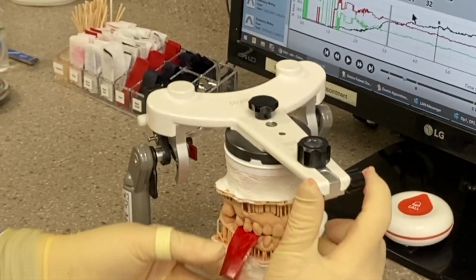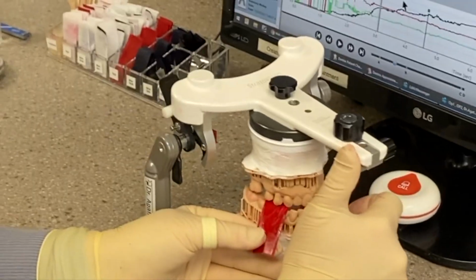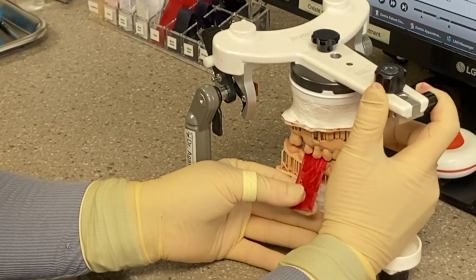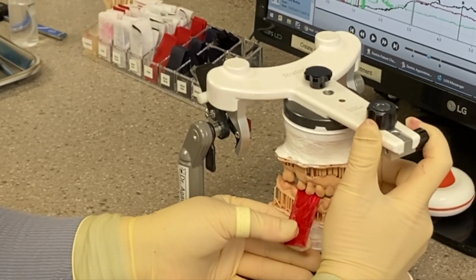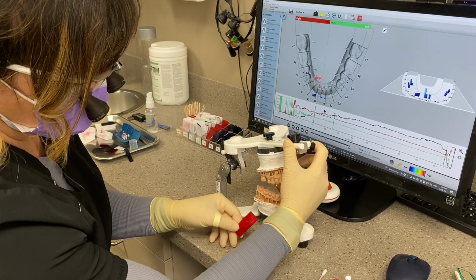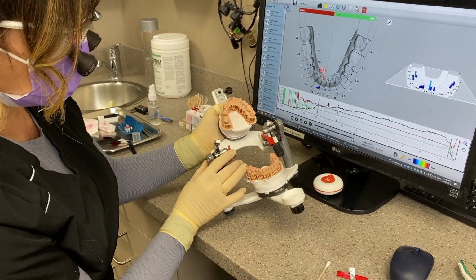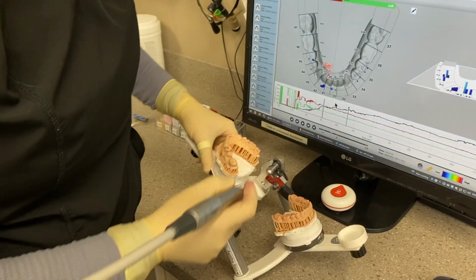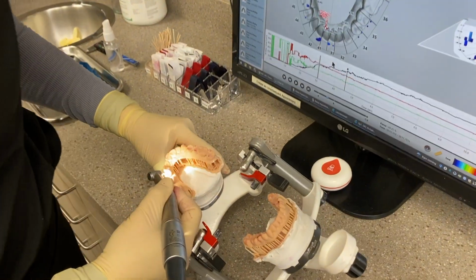So, same thing, just making lateral movements. Mark up that slide. And then I'm literally just going to take out that buccal cusp and reshape it. It's hard adjusting it sitting down.